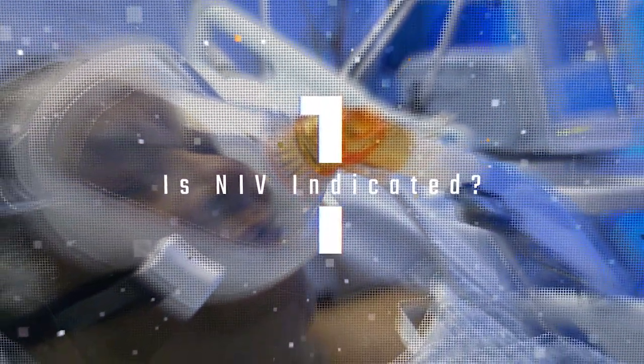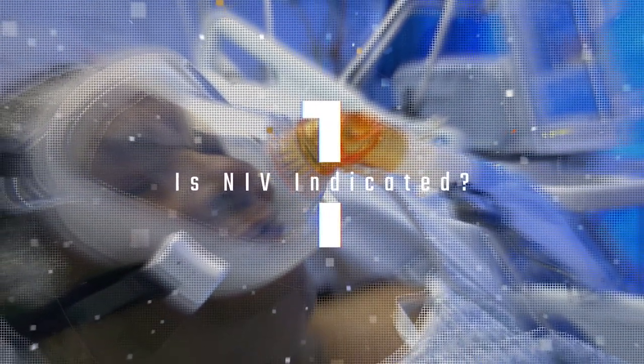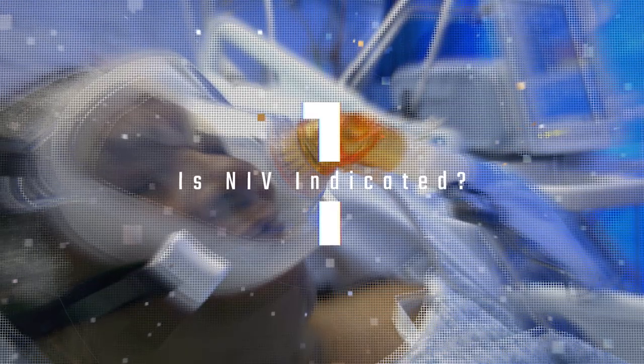Before starting a patient on NIV, there are five essential things to think about. The first one being: is NIV indicated?